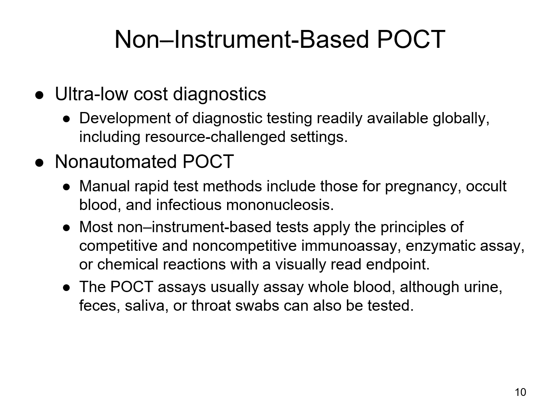It's got a color dye in there, and as those things come together on that little paper, as the urine flows across it and it catches those hormones, it gets caught up in there and starts attaching, then you get the presence of that visible line from that antigen antibody complex. And so these non-automated tests are a lot of test kits and things like that. The COVID test that most of us have probably used. These are all examples of the non-instrument based point of care testing.